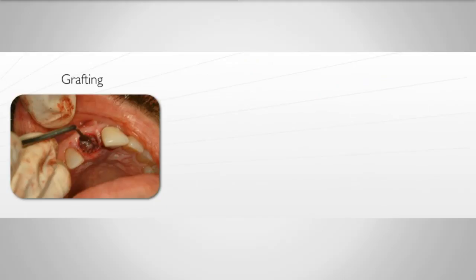What he's doing here is filling the gap. There's a little bit of space again between the buccal aspect of the implant and the cortical plate. You want to fill that in with either autogenous bone or bone substitute, not to prevent ingress of epithelium. That's not going to occur, but to prevent what the Manias call the umbrella effect, to keep the buccal or facial contour there so you don't get a shadow underneath that implant or implant crown.